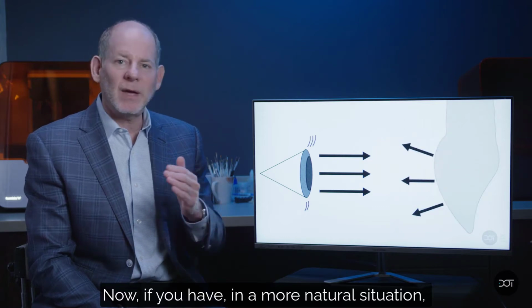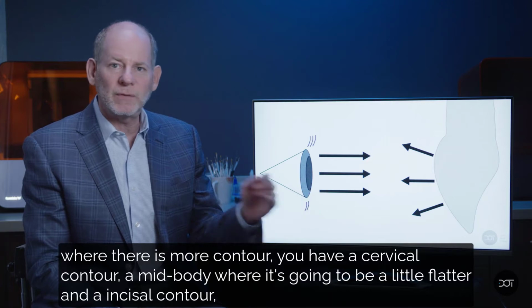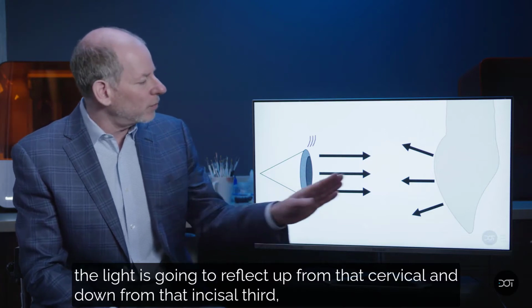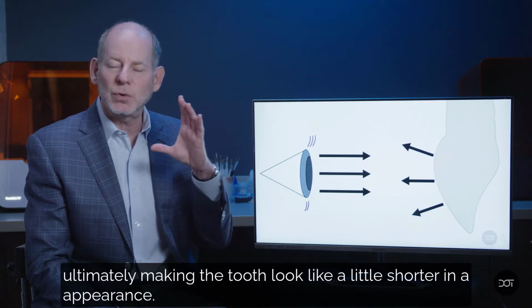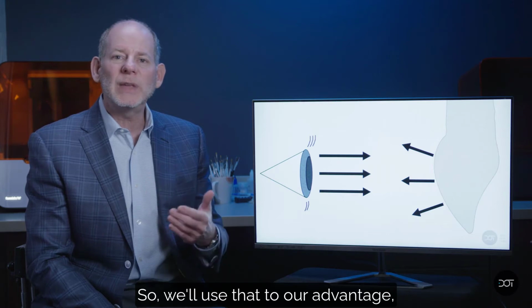Now, in a more natural situation where there's more contour, you have a cervical contour, a mid-body where it's going to be a little flatter, and then the incisal contour. The light's going to reflect up from that cervical and reflect down from that incisal third, ultimately making the tooth look a little shorter in appearance. So we'll use that to our advantage.